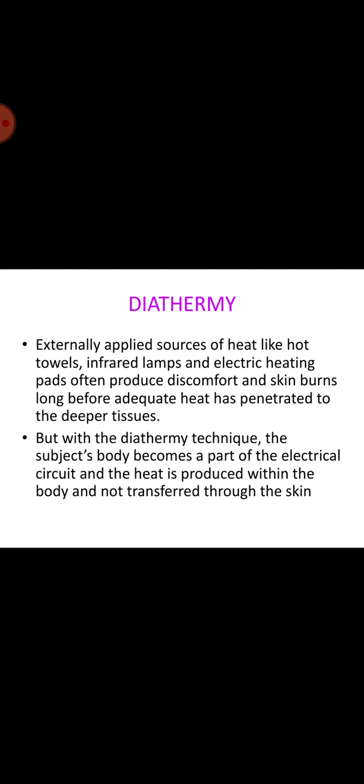This is undertaken by passing sparks from a needle or a ball electrode of small diameter to the tissue. When the electrode is held near the tissue without touching it, an electric arc is produced whose heat dries out the tissue. Fulguration permits fistulas and residual cysts to be cauterized and minor hemorrhages to be stopped.